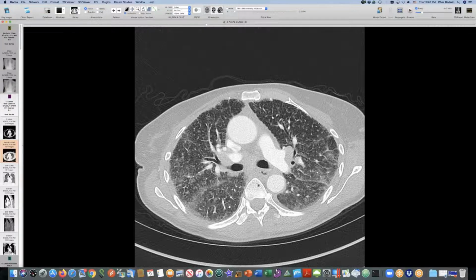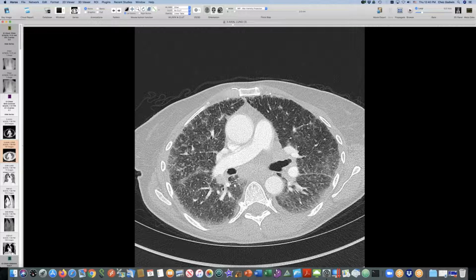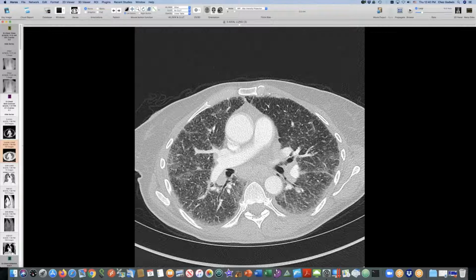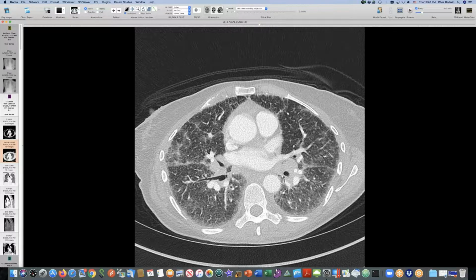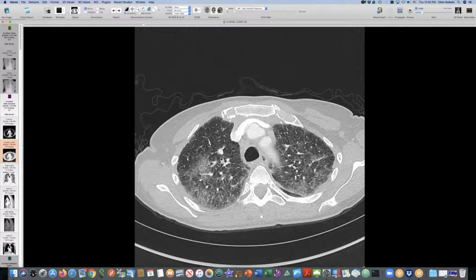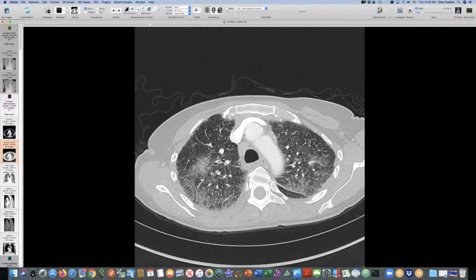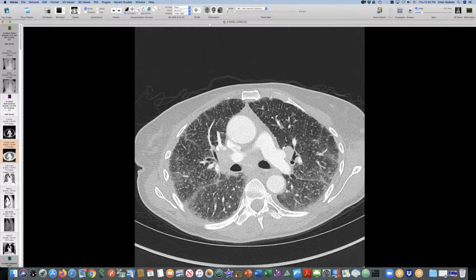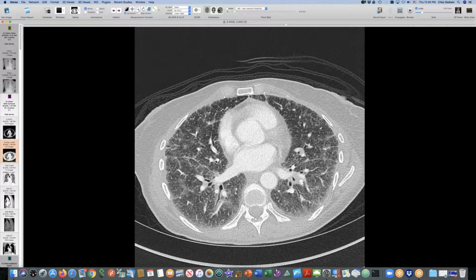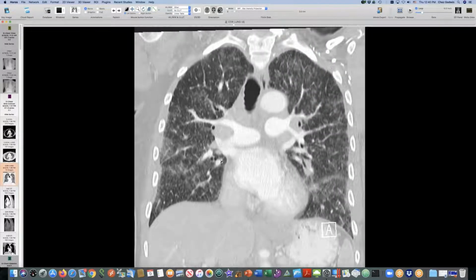There's a ton of lymphadenopathy in here. I don't know whether you can make out maybe small nodules out here. And there's something that's just fuzzing the fissures here. So maybe we have a storm of small nodules, and when nodules are small enough, you can actually get a ground glass abnormality just because you can't resolve the small nodules that are so massed together. So this person has all this lung disease, and I think was a little short of breath. And here it is on CT.